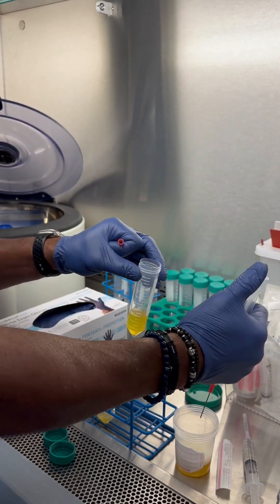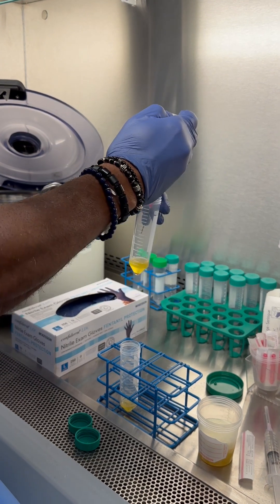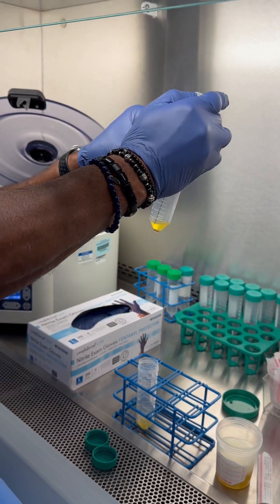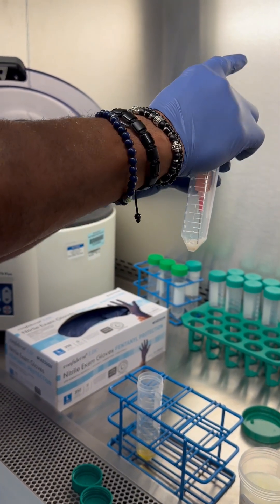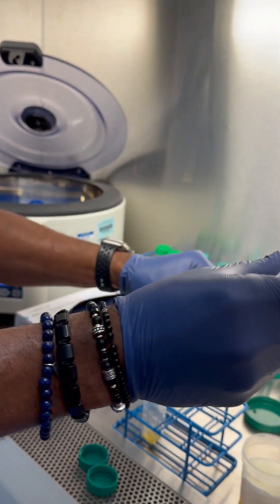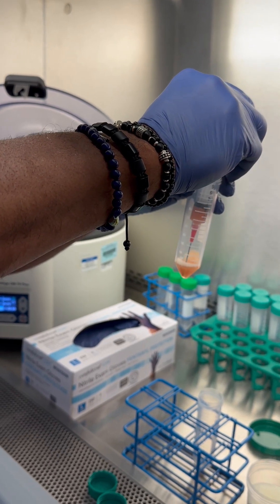I'm going to mix them all together and then we'll sample it. That should be three cc's right there. Now we'll resuspend on this one — you can see we're resuspending the platelets, making sure they're not stuck to the wall. We're mixing up all the PRP now so that when we get a sample, it'll represent the same numbers for both the hip and the elbow injection.